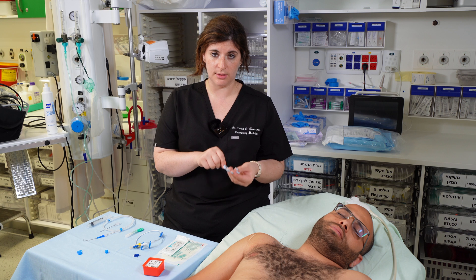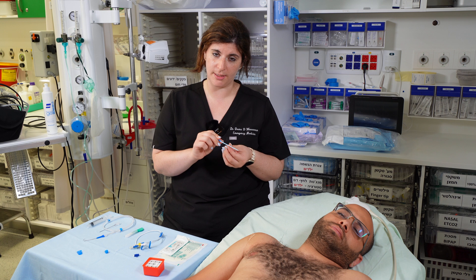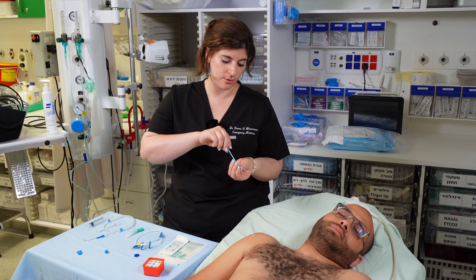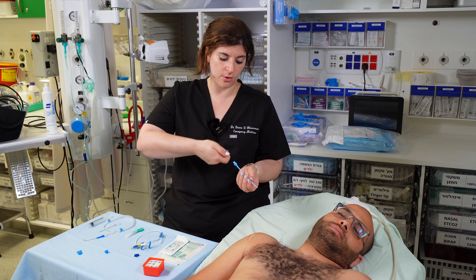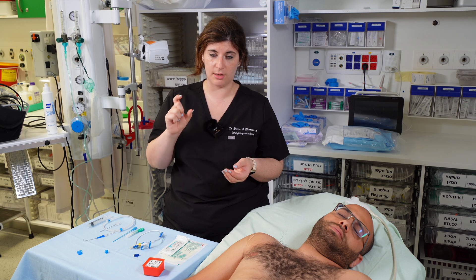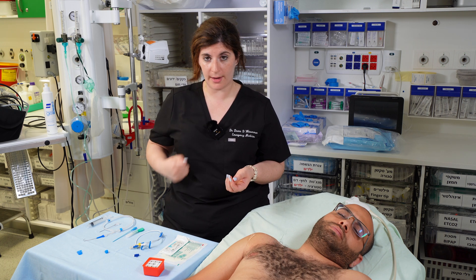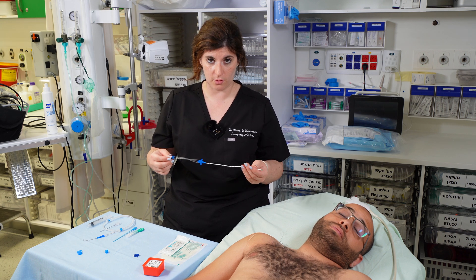When you dilate, don't push from the back — the wire can kink. Hold the dilator very close to the skin and use a twisting and pushing motion. While doing that, hold the wire back here and make sure it stays loose in the dilator. You only need to dilate the soft tissue — you don't need to dilate the vein itself. Once done dilating, back out your dilator and thread your line. Never let go of the wire.